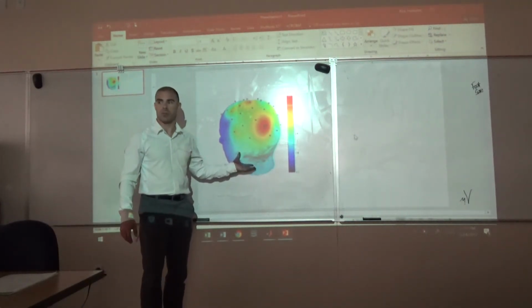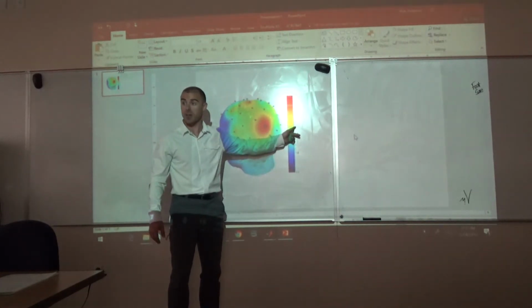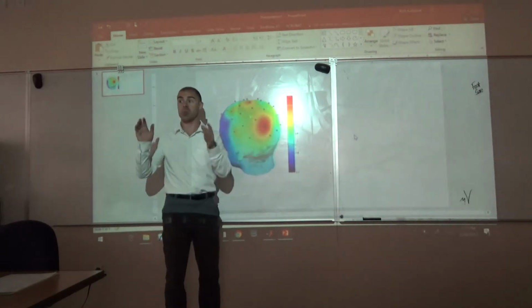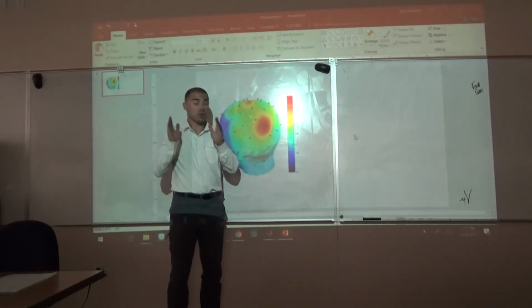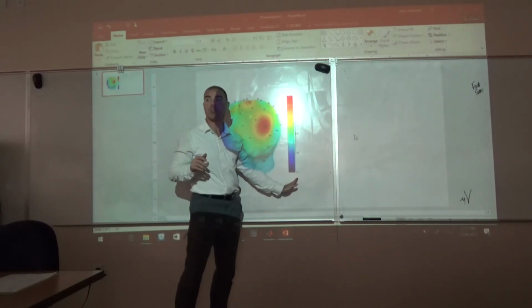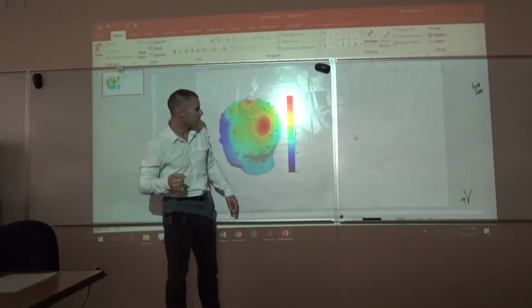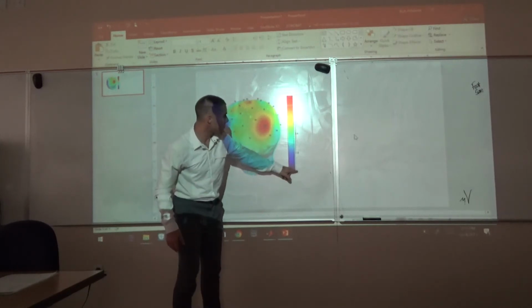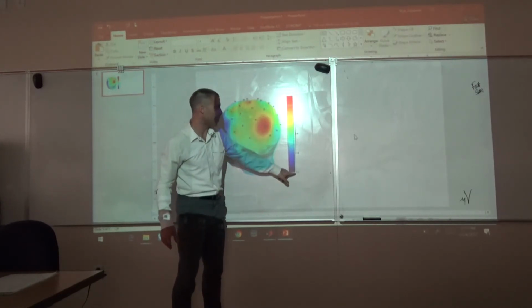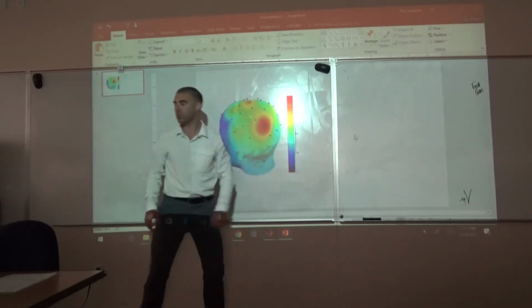Here's what stinks about this. You can't read these, can you? Okay, we need to fix that. So we're going to do that same little nifty trick we just did. We're just going to crop it and cut out these numbers. But before that, you need to make a note. You need to know what they are, because we're going to retype them ourselves. All you need to know is basically what the max and the minimum number is. So know what that is. That looks like it's about 3.2, and this is 1.1.